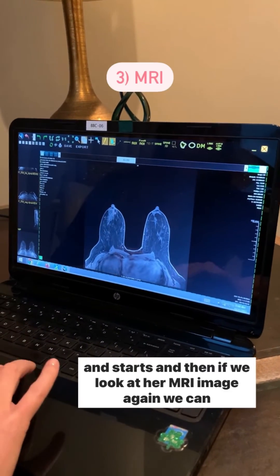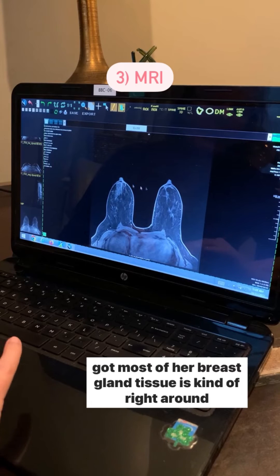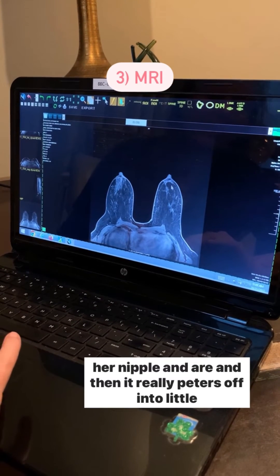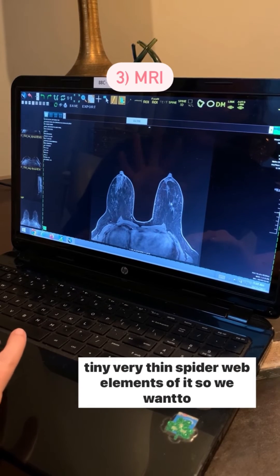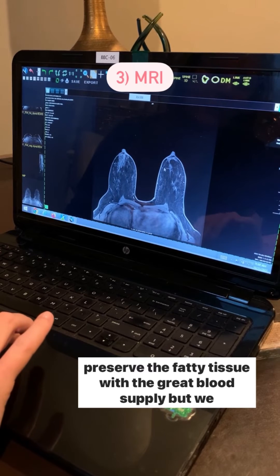If we look at her MRI image, we can see here's her nipple with the breast gland tissue. She's got most of her breast gland tissue right around her nipple and areola, and then it really peters off into little tiny, very thin spider web elements.